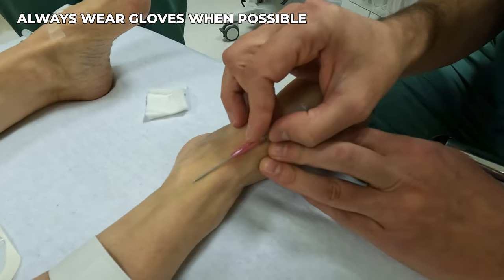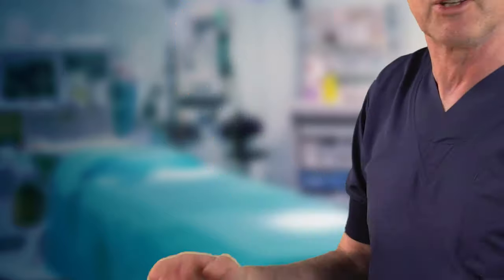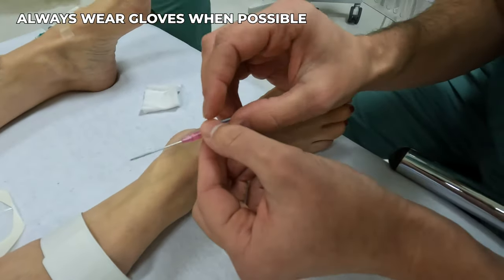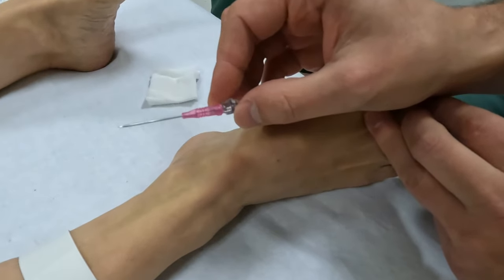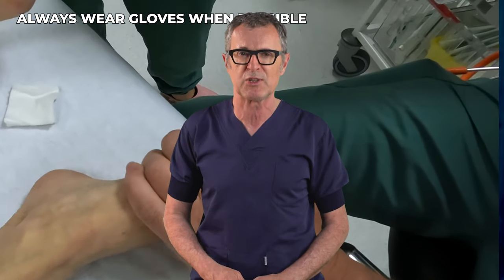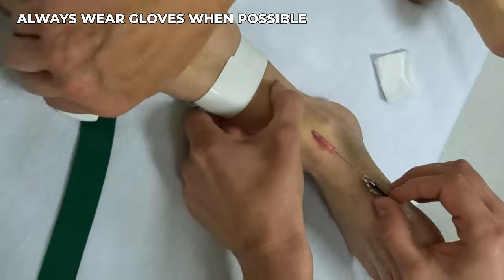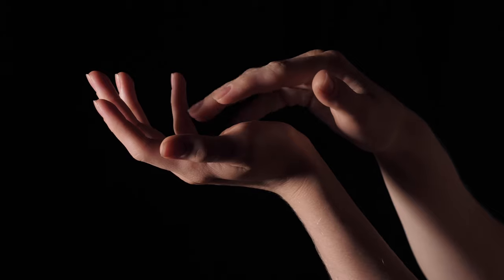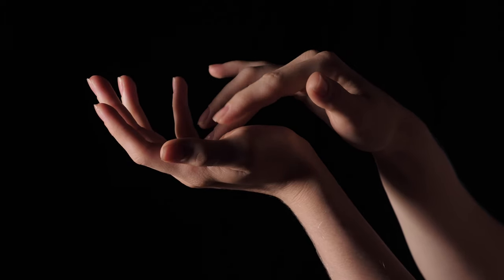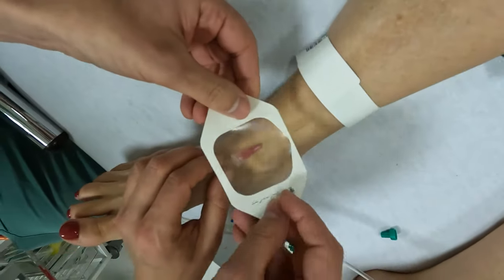Another technique the operator employs to combat vein rolling involves the palm of the hand. He uses the palm of his hand to extend the foot, effectively stretching the skin and underlying vein. This action not only stabilizes the vein but also increases its visibility and palpability, making the insertion process smoother. While it's critical to point out the lack of gloves in this demonstration, it is important to understand that some practitioners struggle with the loss of tactile sensitivity when wearing gloves, which could potentially affect their efficiency and accuracy during the procedure.